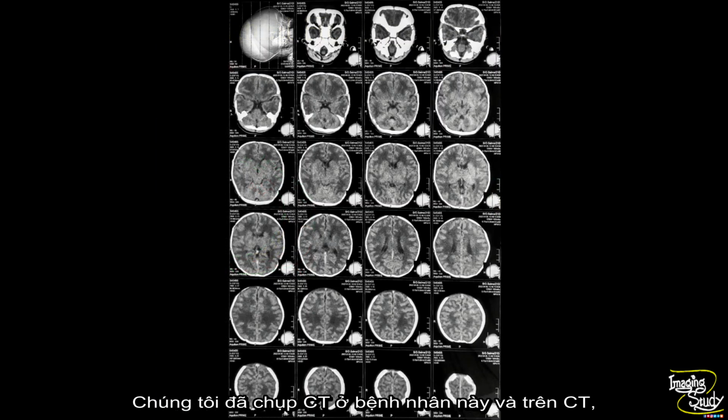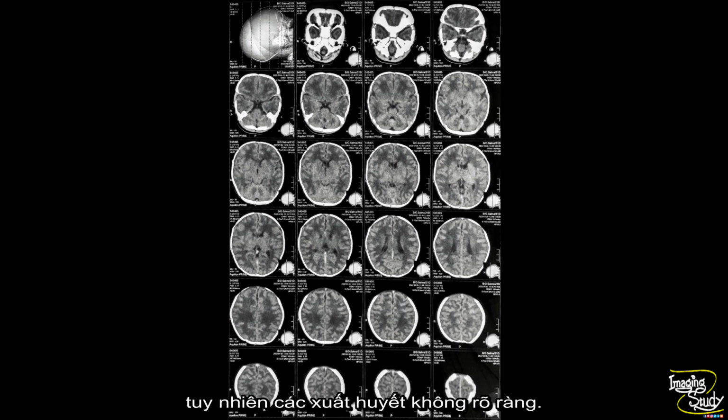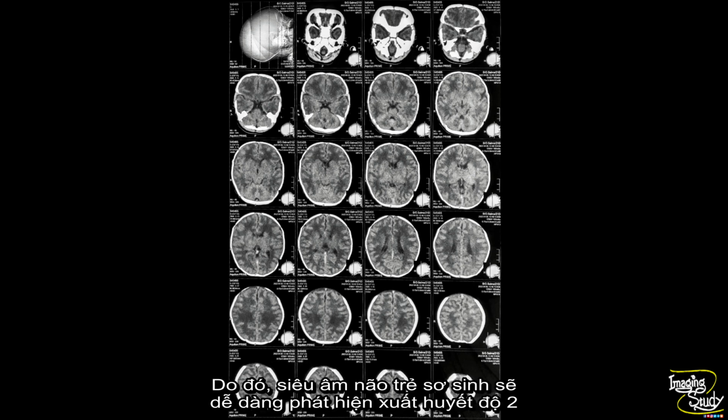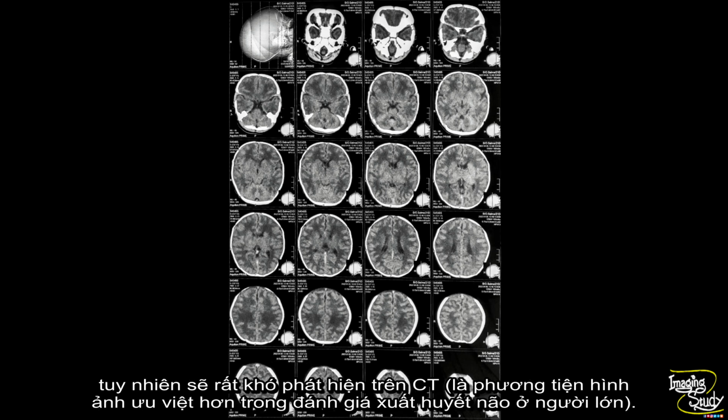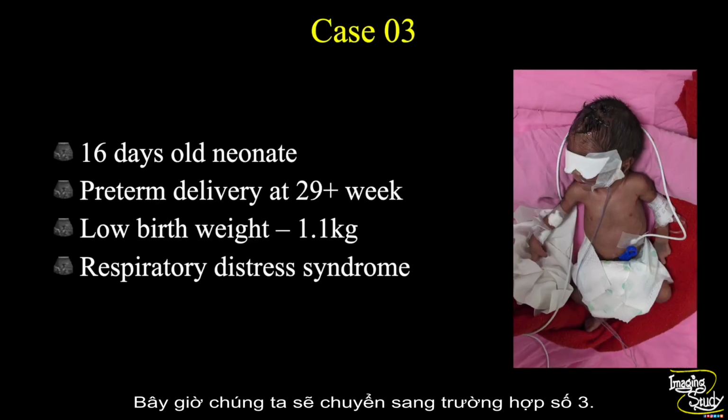Now we have done a CT in this patient, and on CT you can see there is diffuse hypodensity within the brain parenchyma due to hypoxic ischemic encephalopathy, but the hemorrhages are not seen well here. So here comes the superiority of ultrasound in neonates, where you can easily detect the grade 2 hemorrhage, but it's very difficult to locate with CT scan, which is the superior imaging modality to assess brain hemorrhage in adults. Now let's jump into case number 3.